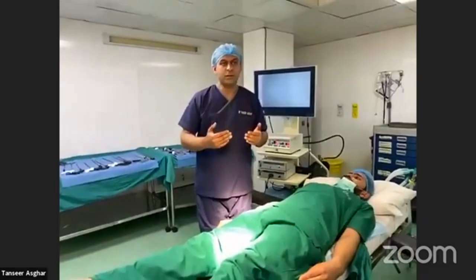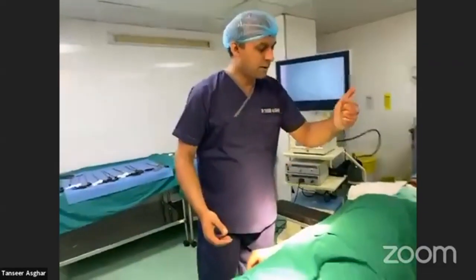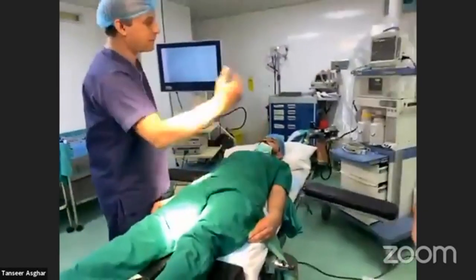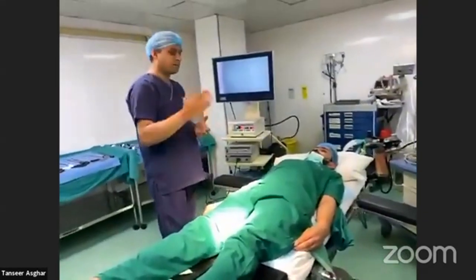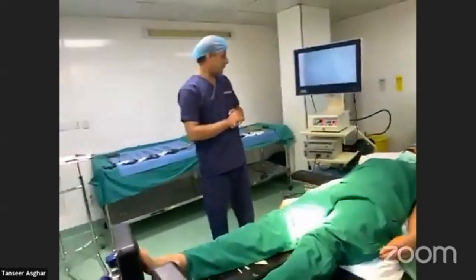In advanced procedures such as bariatrics, the surgeon stands between the legs, the cameraman is on the right, the person retracting the liver is on the right of the patient, and the first assistant is on the left. The same general principles apply to colorectal and upper GI cases, though specific techniques vary.